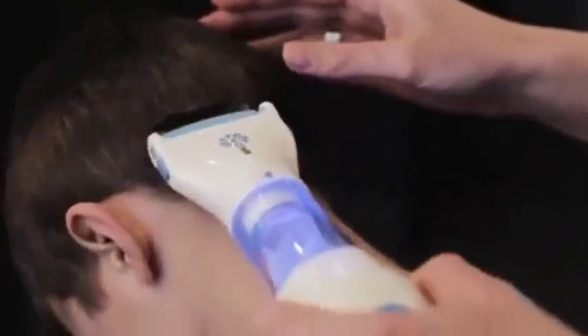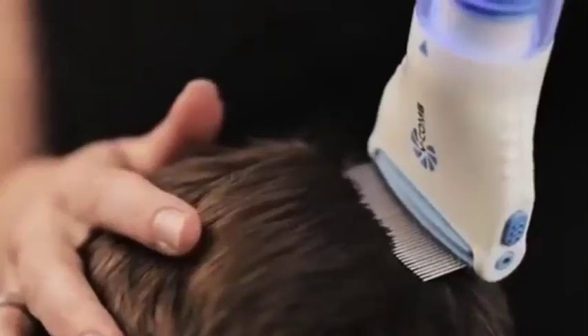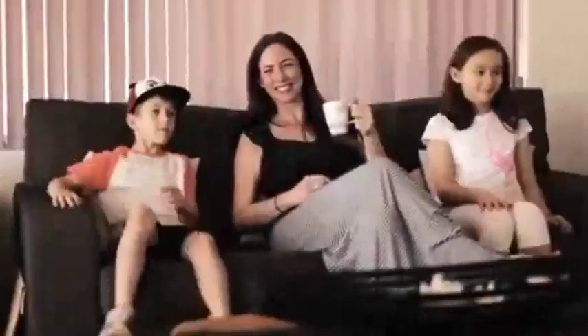Treating head lice infestations has become safer and easier with the V-Comb, combining innovative design and functionality into a simple and easy to use product that is a must-have for every home.